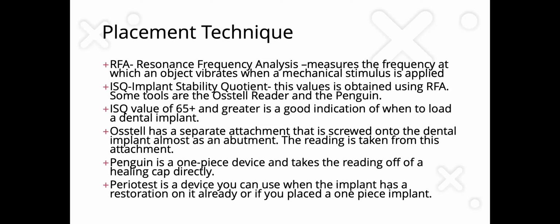A Periotest is a device you can use when the implant has a restoration on it already, so you don't have access to placing a smart peg on there, in a case like a one-piece implant, or when you have a crown on a dental implant.